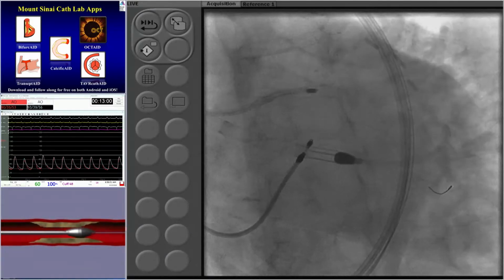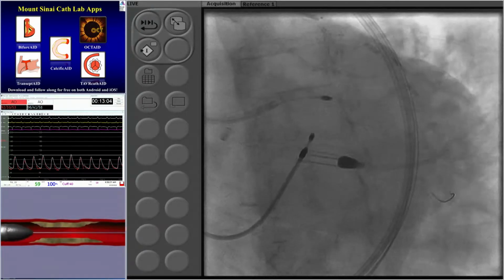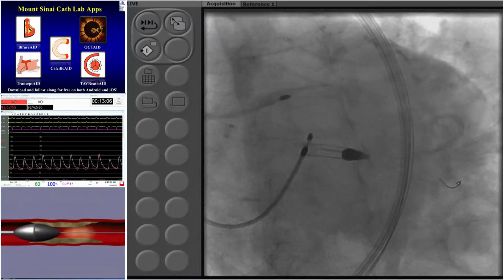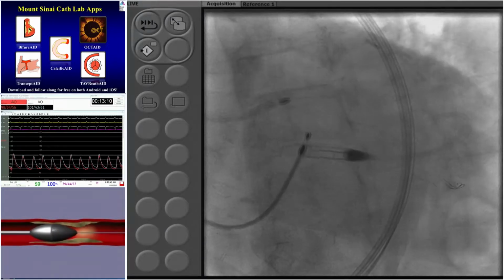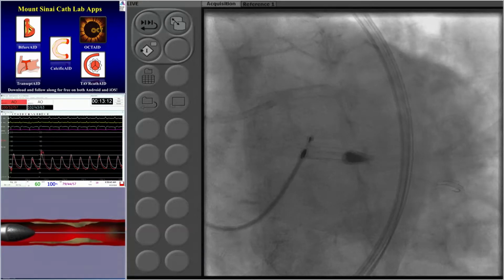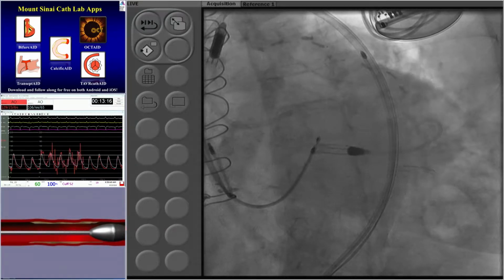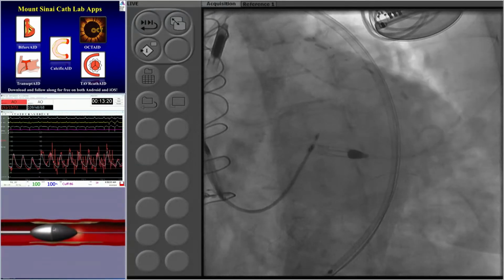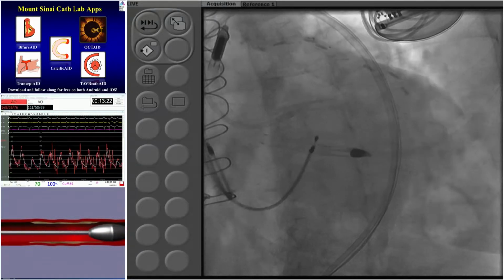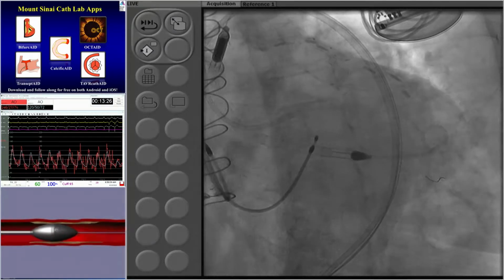Good. And the point was made by Dr. Keeney also, that the key is that you don't need to go to the bigger burr unless it is necessary. So what we'll do is put a wire side by side, dilate the vessel, and if it can expand, you don't need to go to the bigger burr, and only go to the bigger if necessary. But otherwise, 1.5. Did you guys get any ischemic MR there?